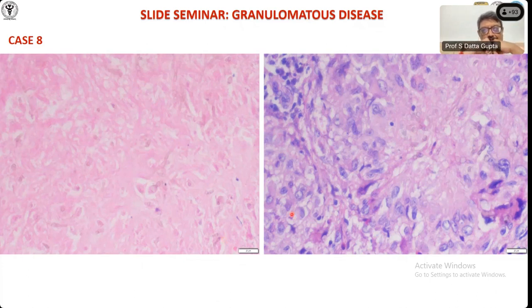Even in the immunocompromised, TB is again the most common thing. But of course, if you have seen some organism. That's why I showed the next slide. What did you see in this? Fungal spores, yeast-like organisms, with marked variation in their size, sir.